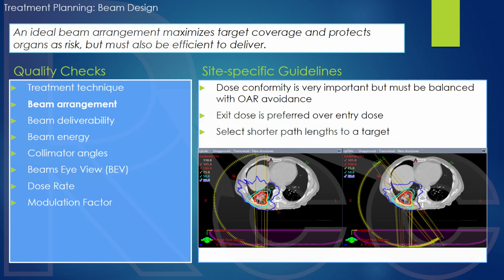Okay, thank you, Dr. Lin. One more question. There's one more question about the beam. Would you prefer to treat SRT patients using the FF beam with non-coplanar VMAT, or would you choose FFF beam without the couch rotation? I think the question touches on non-coplanar a little bit more in a future slide. Yeah, let's pause for a moment and come back to that one. Okay.